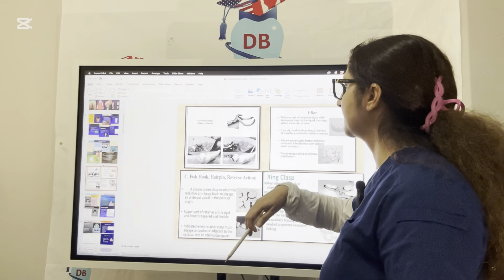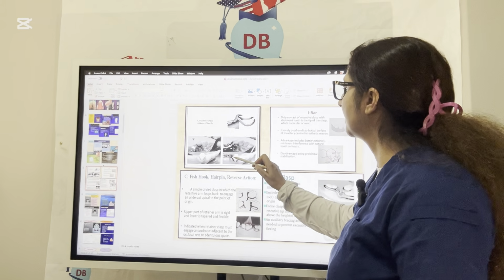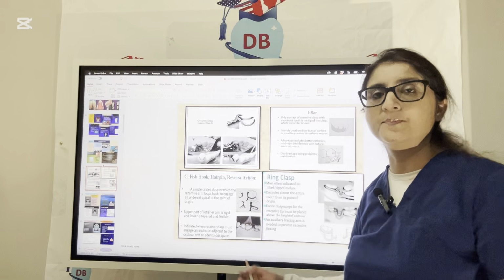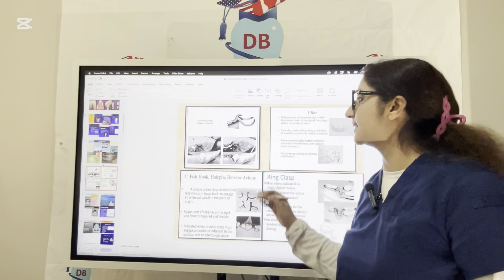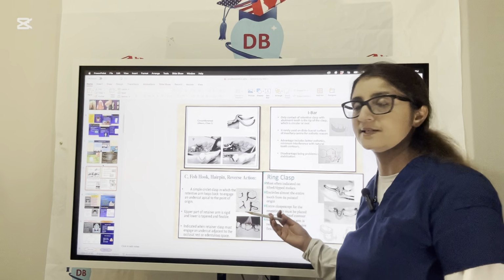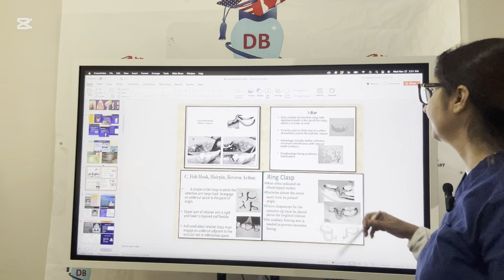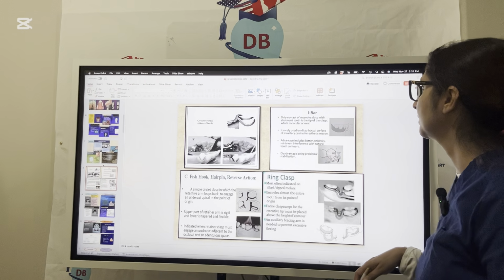You can see some of the designs here. So this is a circumferential clasp. I told you, the Akers clasp. You can clearly see it approaching the undercut from above the height of contour. It is satisfying all the principles of clasp assembly, which include stability, retention, support, reciprocation, and the very important encirclement property, that is, it is engaging more than 180 degrees of the circumference of the tooth, and passivity. And this I-bar you can see here. The I-bar is the one that we use for the RPI design. I already explained the RPI design: better aesthetics and minimum interference with the natural tooth contour.